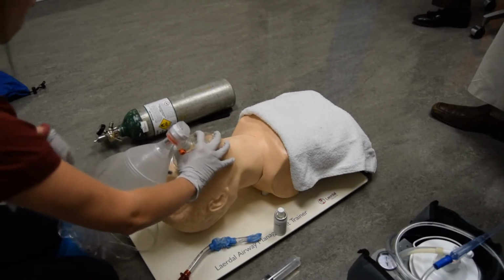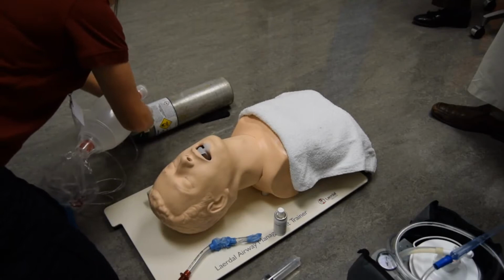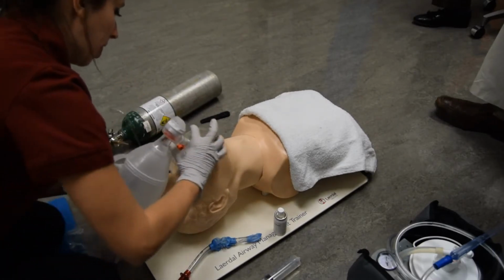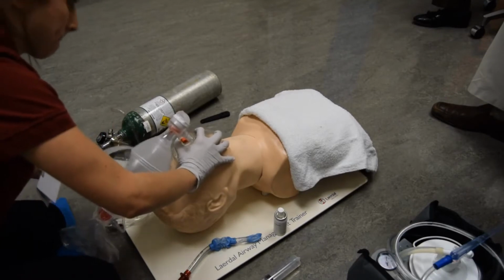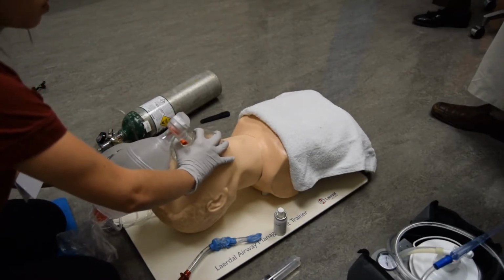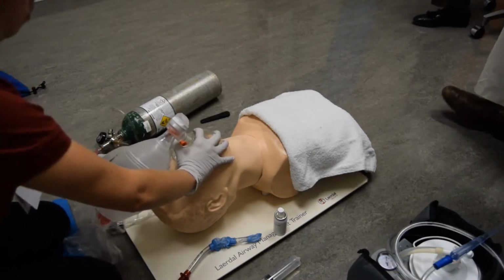Attaches oxygen reservoir to bag valve mask device and connects to high flow oxygen regulator, 12 to 15 liters per minute. Ventilates patient at a rate of 10 to 12 breaths per minute with appropriate volumes.